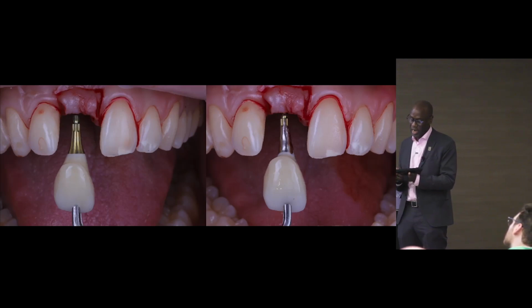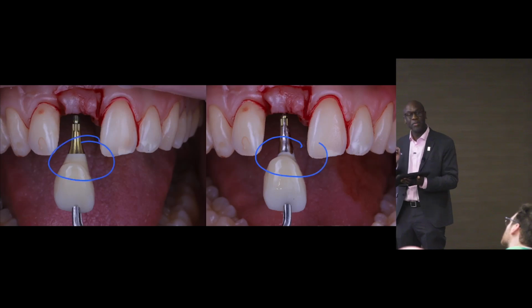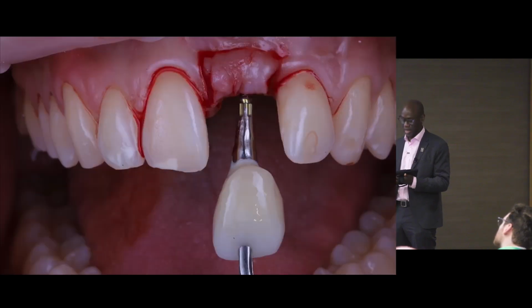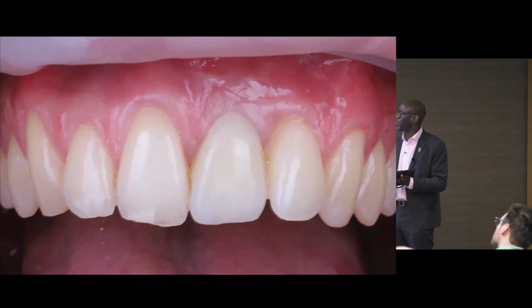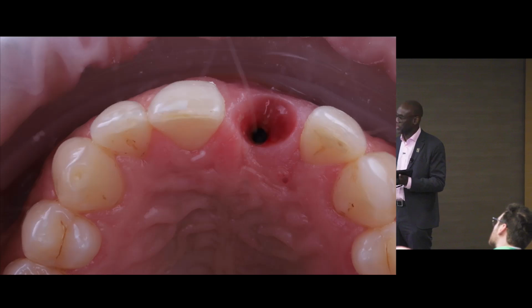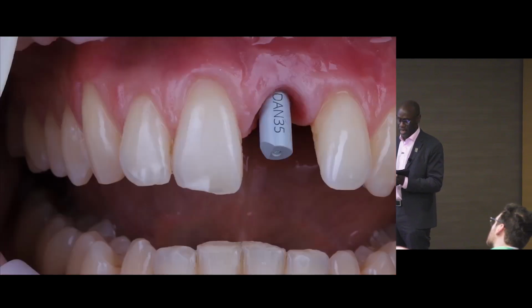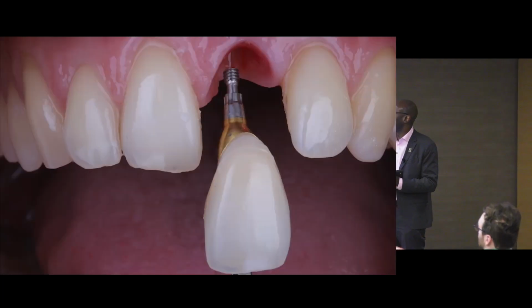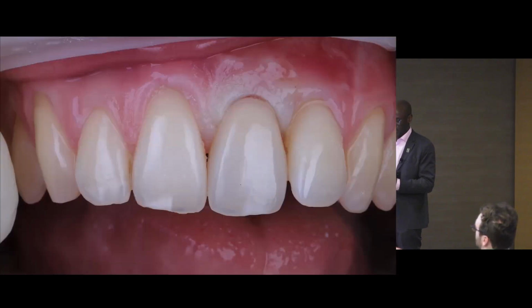So here you've seen how I've had to customize that tie base for the same critical and subcritical contours there. That's what I'm used to having to do, to get something like that, trim it, and just going all the way through. That's the patient with the provisional. And again, here you see the scan body in place, and again, just finishing that off with something that's customized.